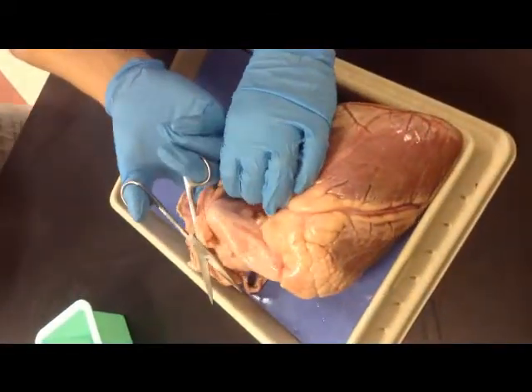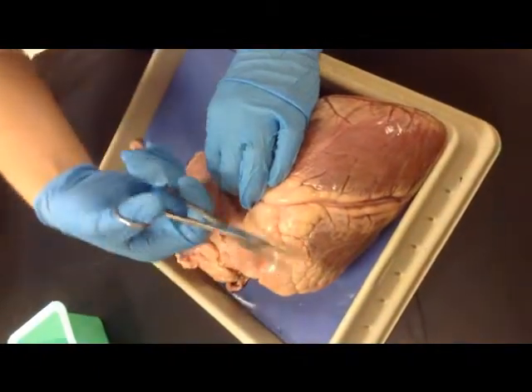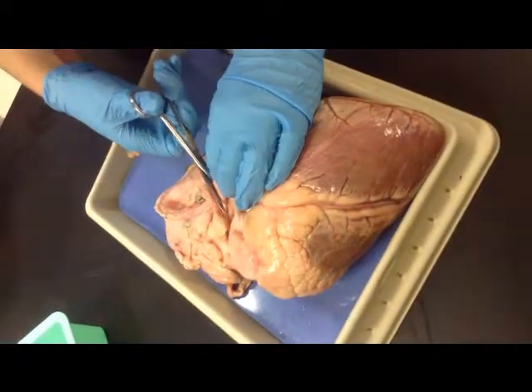We're going to be cutting the pulmonary artery into the right ventricle, parallel to the groove of the coronary artery.